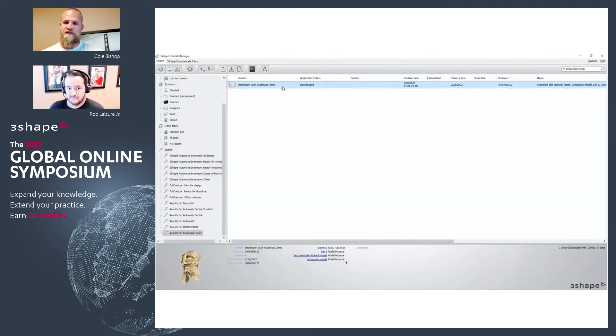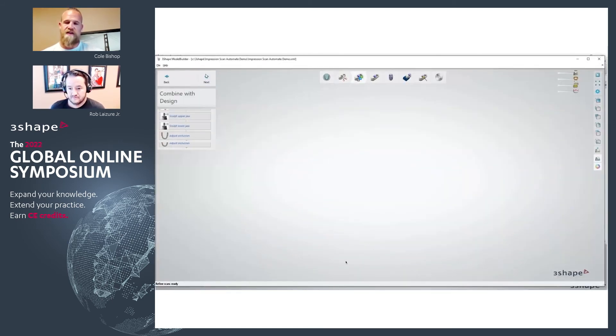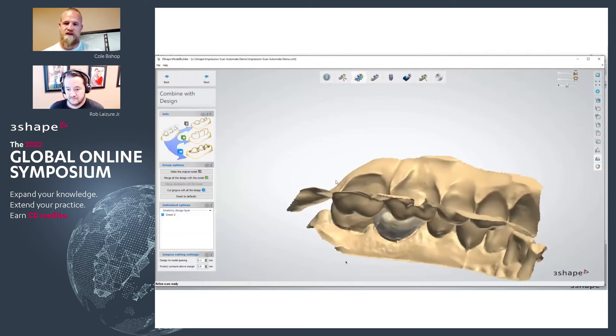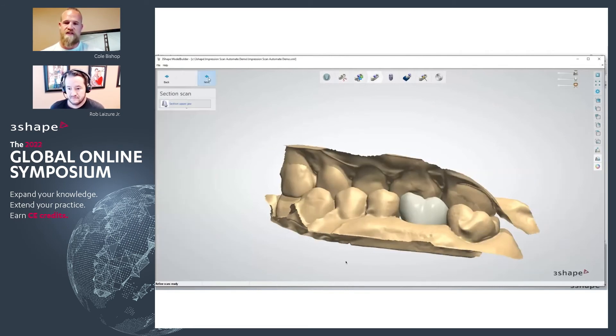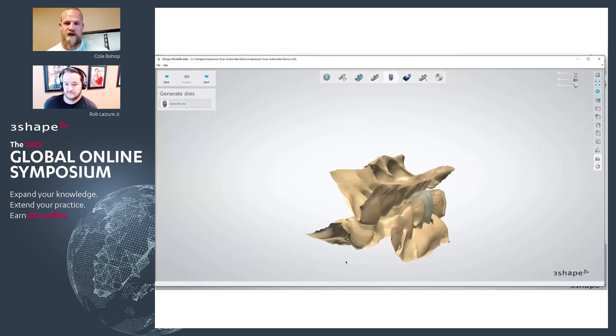You have your crown ready to go and all you have to do is go straight into model builder. That's going to maintain all the information as far as the margin marking goes, so that the removable die will have some consistency between the crown design and the model.